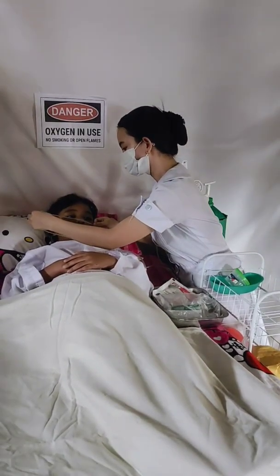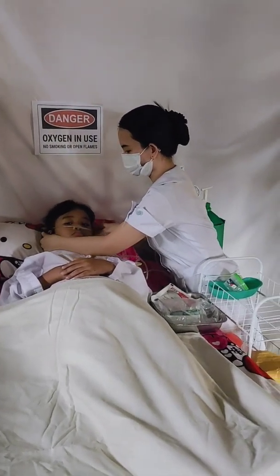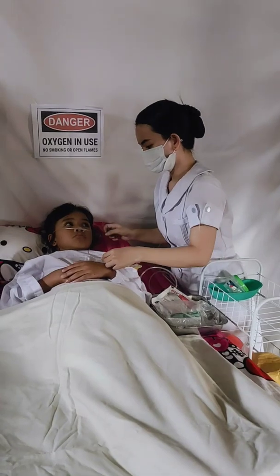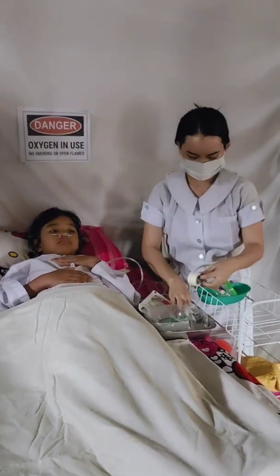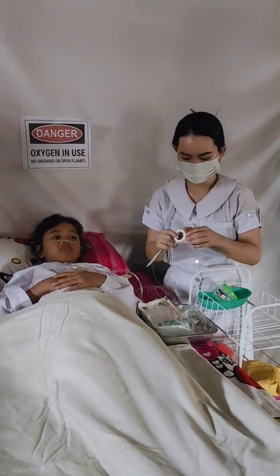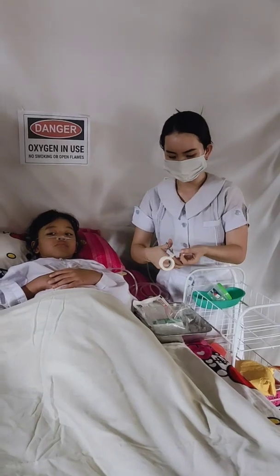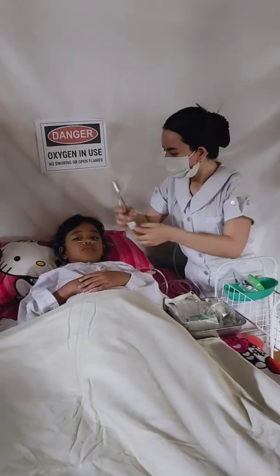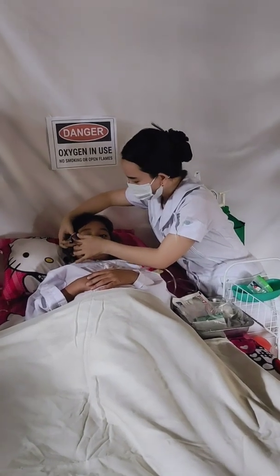Next is place the prongs in the patient's nostrils. Place tubing over and behind the ears with the adjuster comfortably under the chin. If the cannula will not stay in place, tape it at the side of the face. Adjust the fit of the cannula as necessary. Tubing should be snug but not tight against the skin. The rationale for doing this is that proper placement ensures accurate administration.